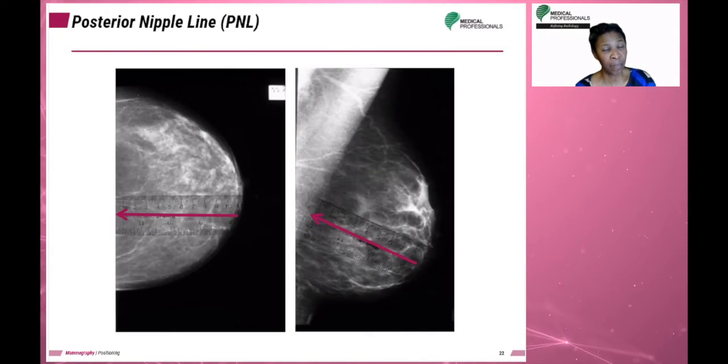I have done it in the past, imaged the mastectomy site, and I've also worked at facilities where they do not recommend that you image the mastectomy site. Normally, when a patient tells me they've had a mastectomy within the last few years, I'll immediately ask them, are you having the site inspected or visually checked by your doctor? So that hopefully they will follow up in that way, because like I said, you can have a cancer developing at the mastectomy site.